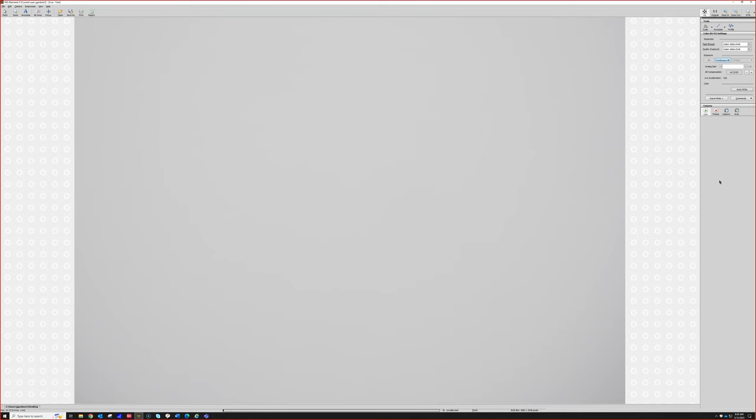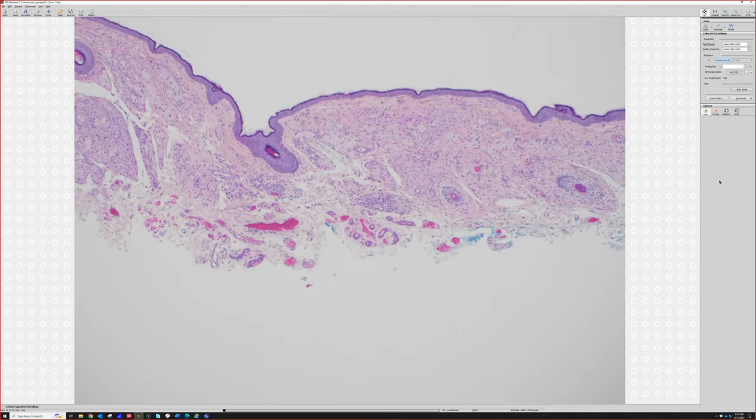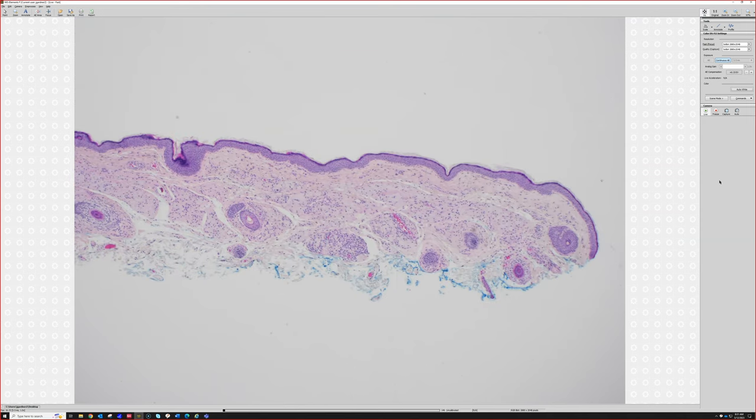And some people find CD123 helpful because it highlights clusters of plasmacytoid dendritic cells in many cases of lupus. I personally find it kind of a challenging stain to interpret, but in any case, for test purposes, know that CD123 clusters is a finding that favors lupus. Not just discoid, but lupus erythematosus in general.